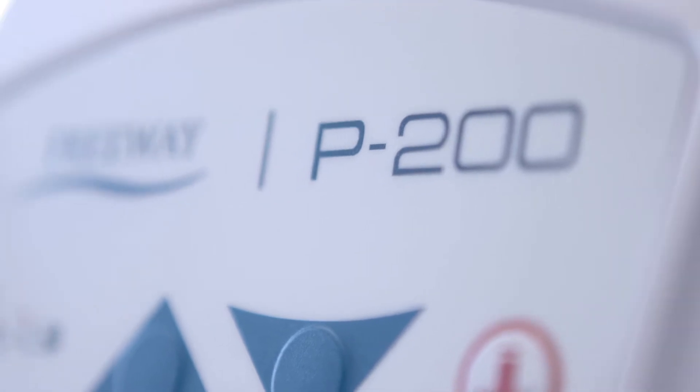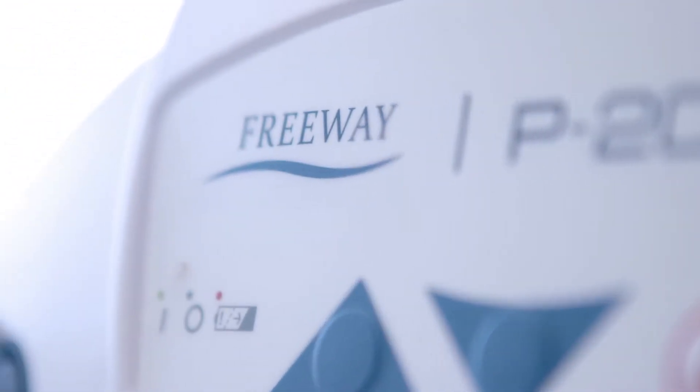Ceiling hoists are designed to prevent caregiver injury and make lifting safer and more comfortable for the resident. The P200 is a lightweight, easy to operate, portable hoist and can transfer a person weighing up to 200 kilograms.